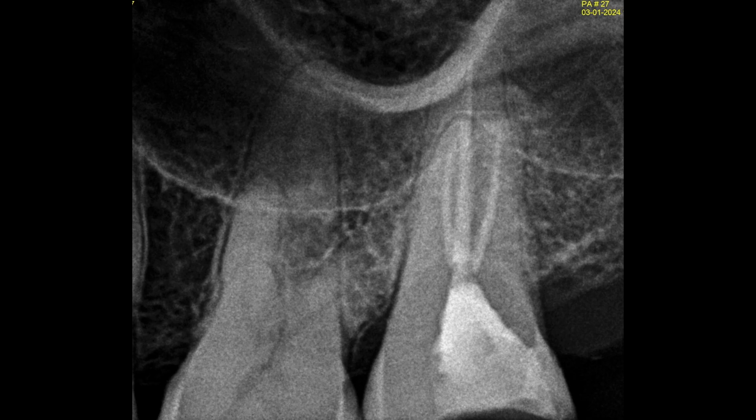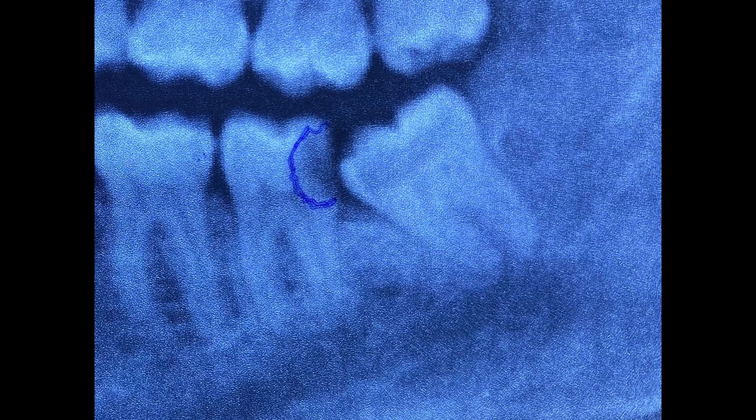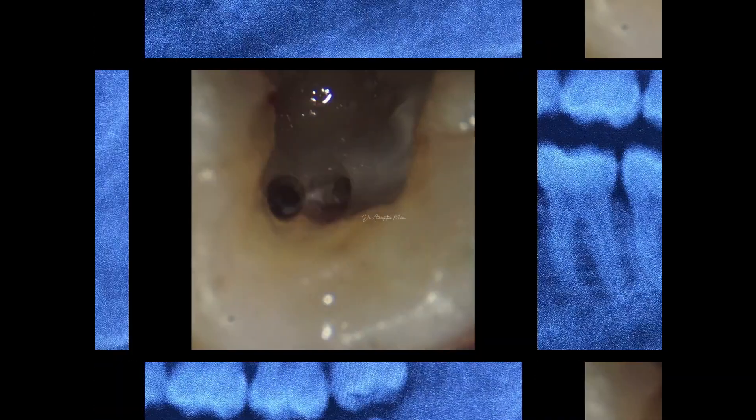This is the final post-op of the first case. The second case is again a left mandibular second molar. This is a referred endo, so I have to refer the case back after the root canal to the referring dentist.